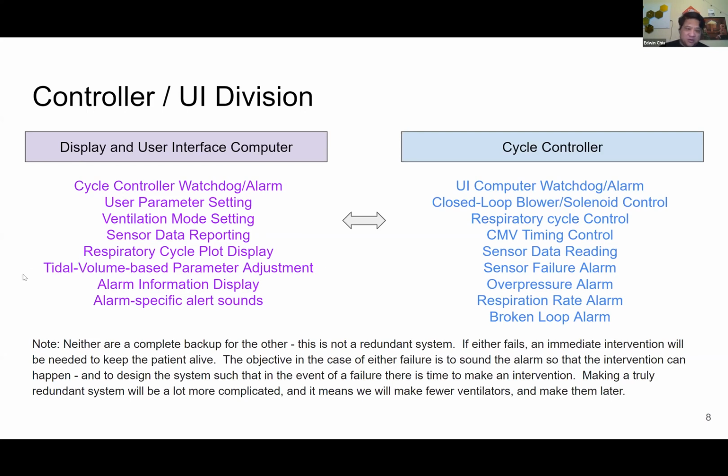Now, this is something that we're still working on, but the thing about tidal volume is that it is not something that operates on a 1/100th or 1/10 of a second time scale. You actually have to observe several breaths of the patient to determine the tidal volume. So this one requires some memory and storage of those parameters. The nice thing about tidal volume is that you don't have to respond to it right away. The machine has a minute or two to make a decision and to change this. If it doesn't immediately command the tidal volume on every cycle, the cycle controller will simply continue the breathing of the patient unobstructed.